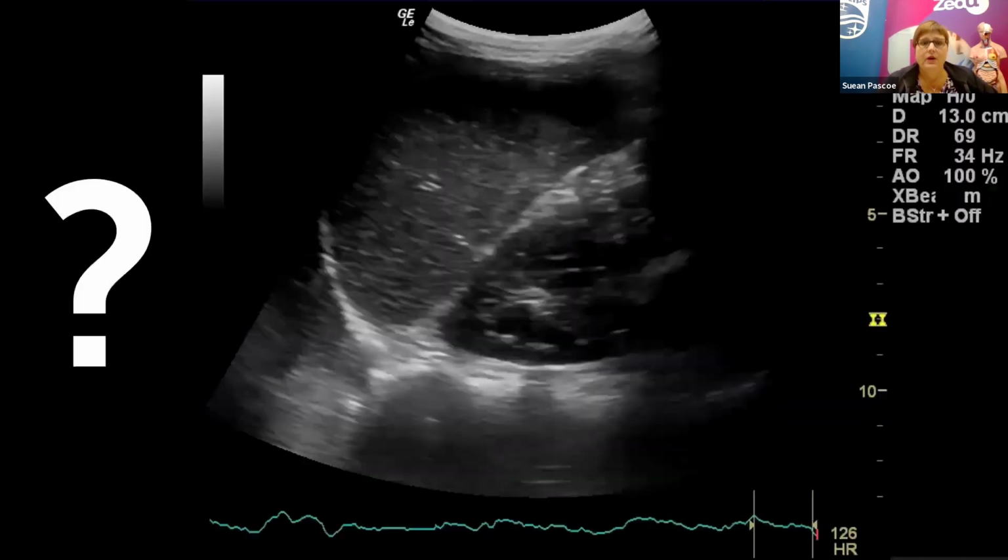So the next question I'll ask is, what question were you asking? Why did you do this point of care study? What question were you asking, and what did you expect the answer to be? Because an ultrasound or a point of care exam should be used to answer binary questions. If they're asking the wrong question and performing the wrong test, then it might be out of scope and not appropriate to be performing that exam in an emergency context.